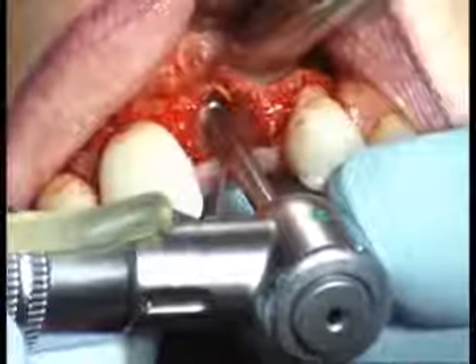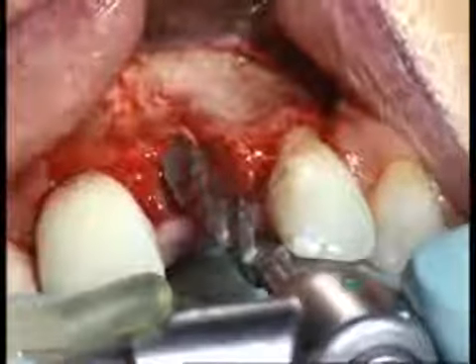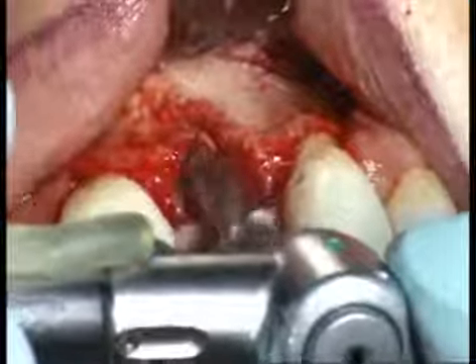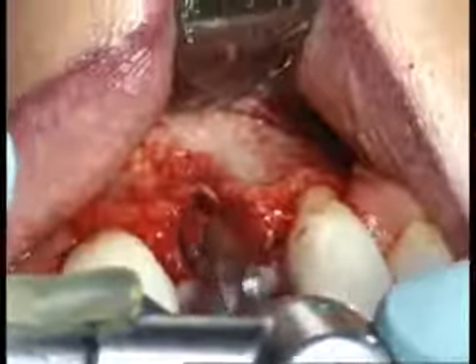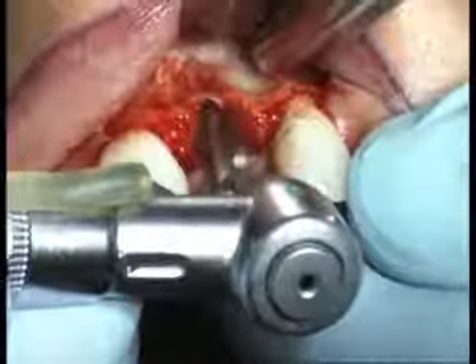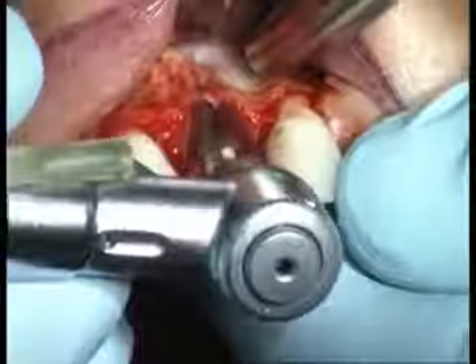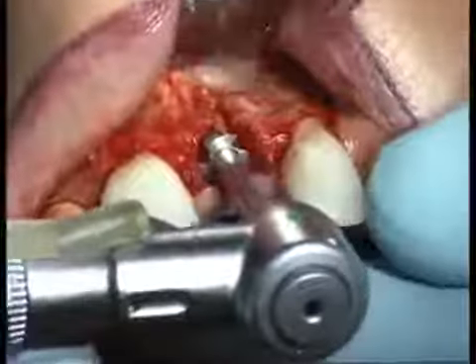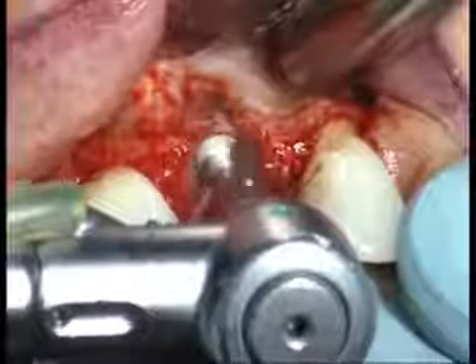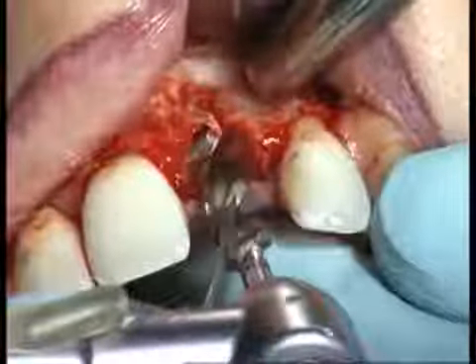The third round burr gives the bone margin a slight bevel so that the 3.5 mm twist drill can be easily inserted into the implant bed without slipping. Bone preparation requires adequate cooling. Finally, the implant bed is widened with a profile drill in order to properly insert the twist drill with a 4.2 mm diameter.